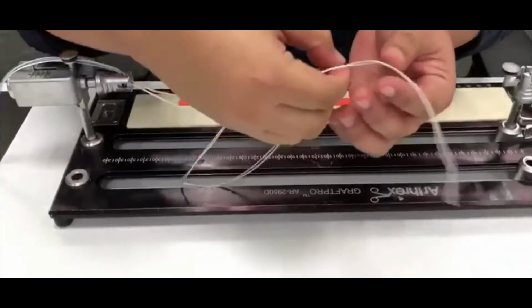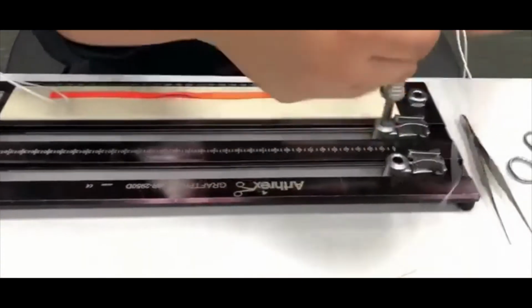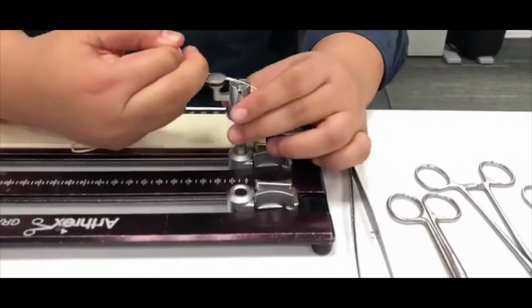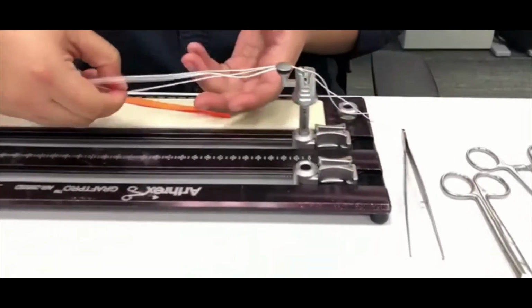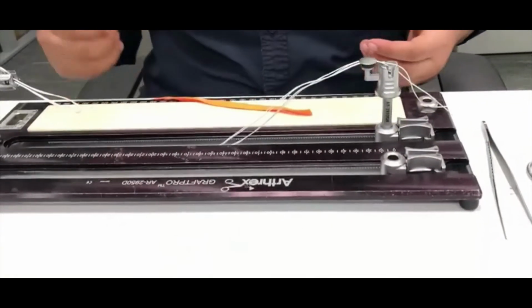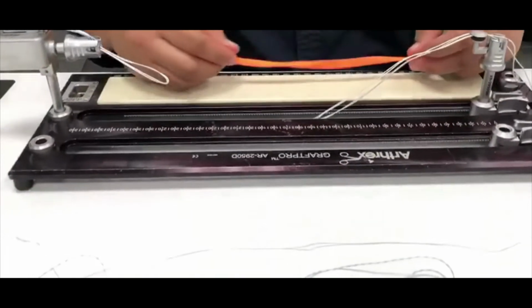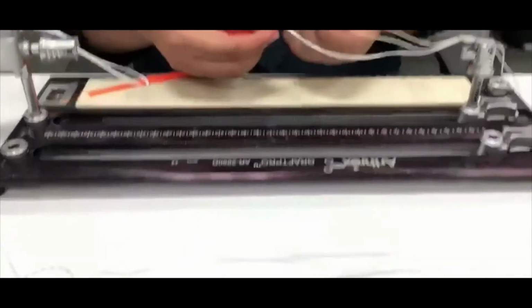The other TightRope is for the tibial side, and the loose strands are also away. So you take the junction, slot through the rubber band, and pull tight to secure. Then it will be attached. Once the graft is cleaned and ready, you will start from the tibial side.